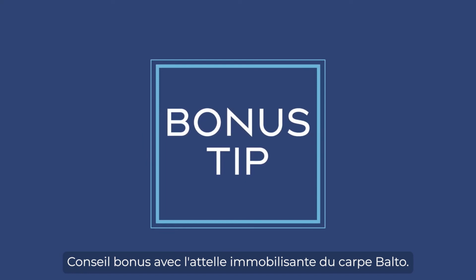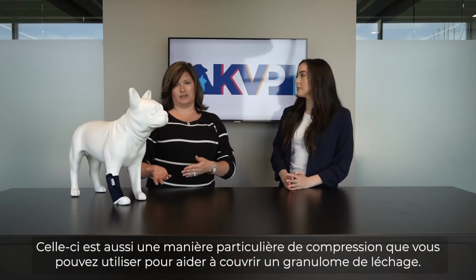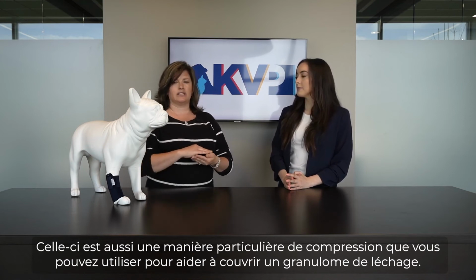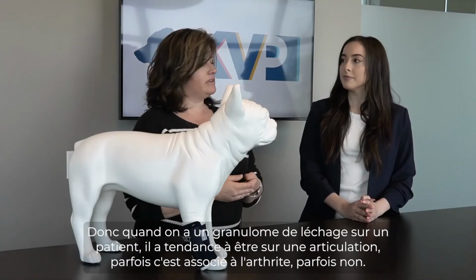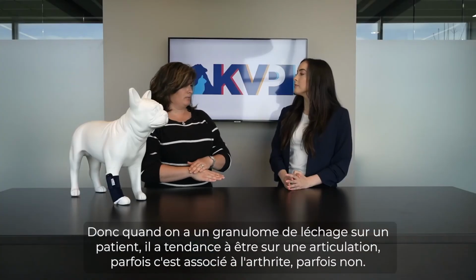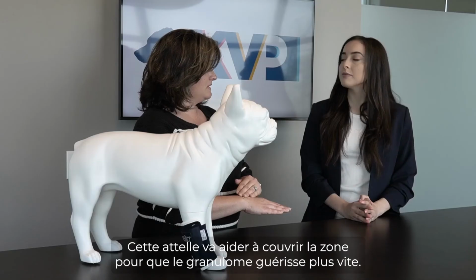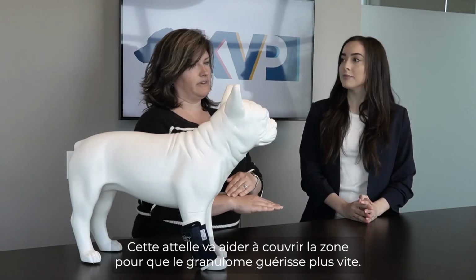So one of my bonus tips with the Balto joint is that this one is also a particular compression band that you can use to help cover a lick granuloma. When we have a lick granuloma on a patient, it tends to be on a joint. Sometimes it's associated with arthritis, sometimes it's not, but this particular band will help cover that up so that the lick granuloma itself will heal faster.